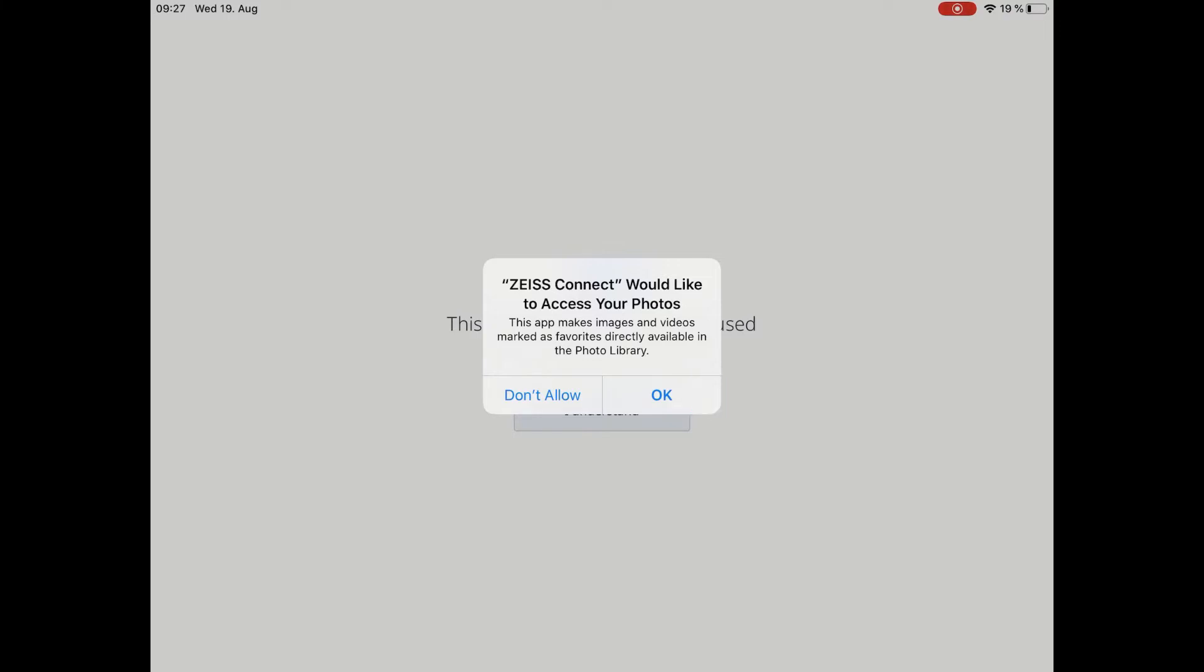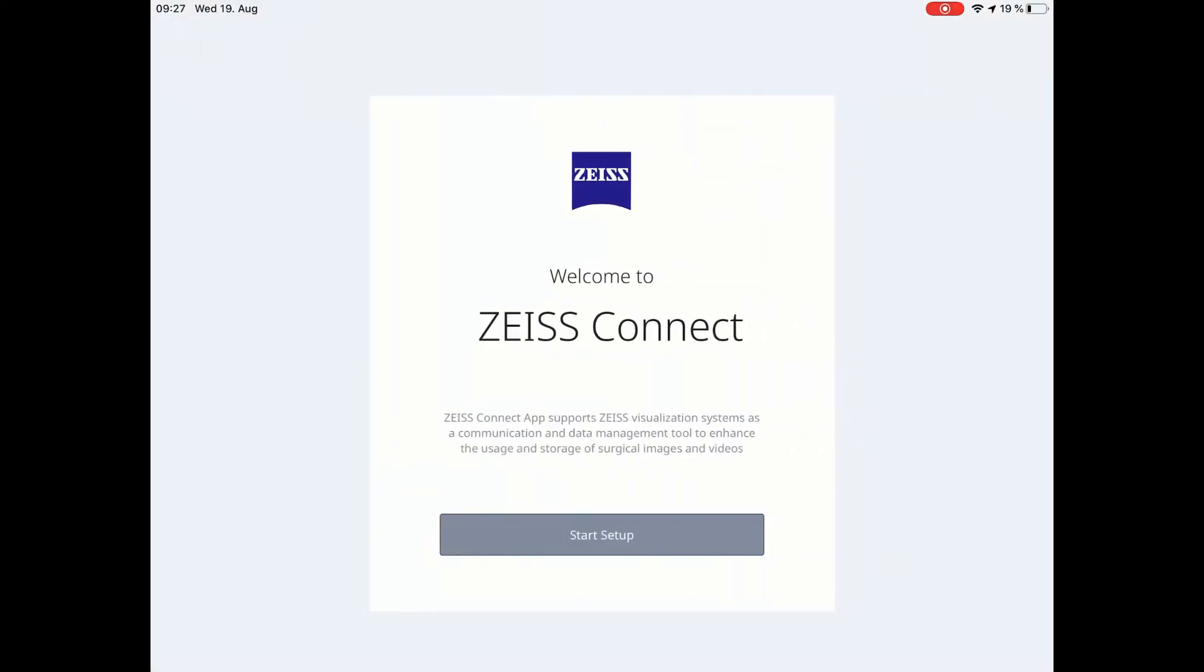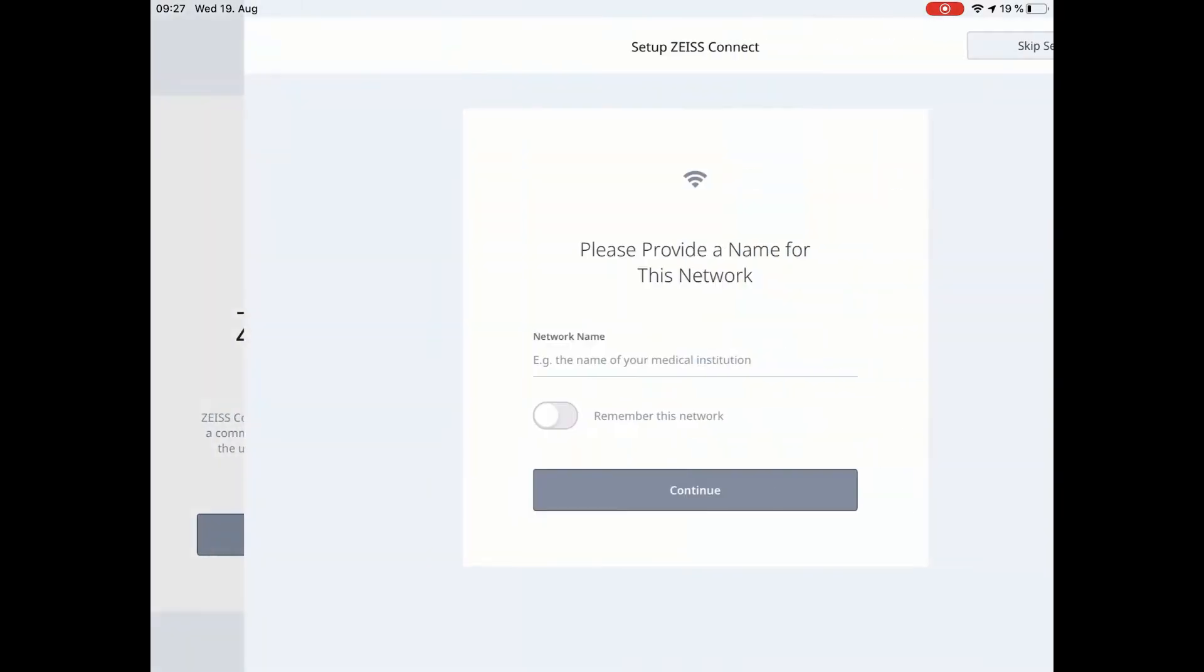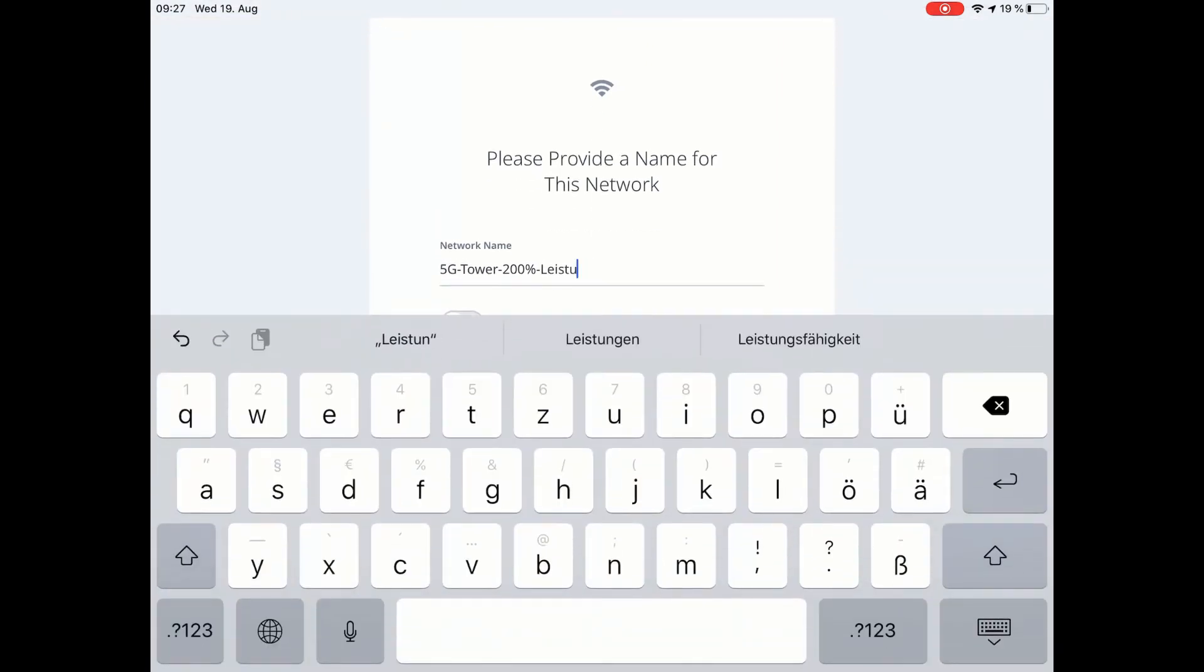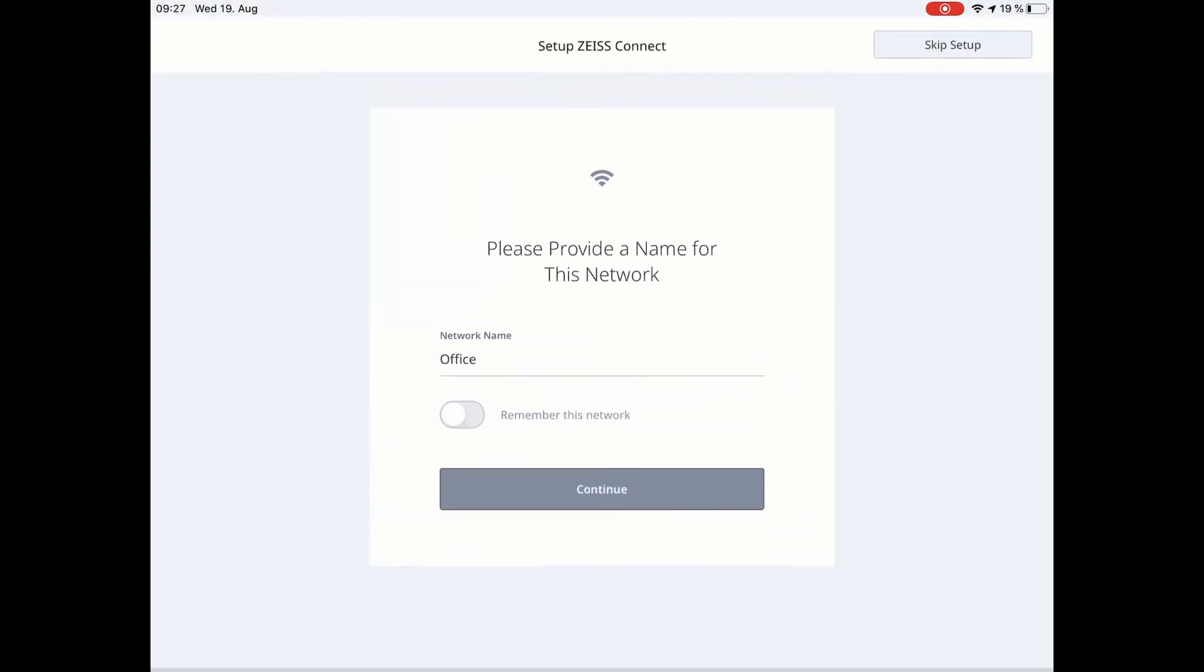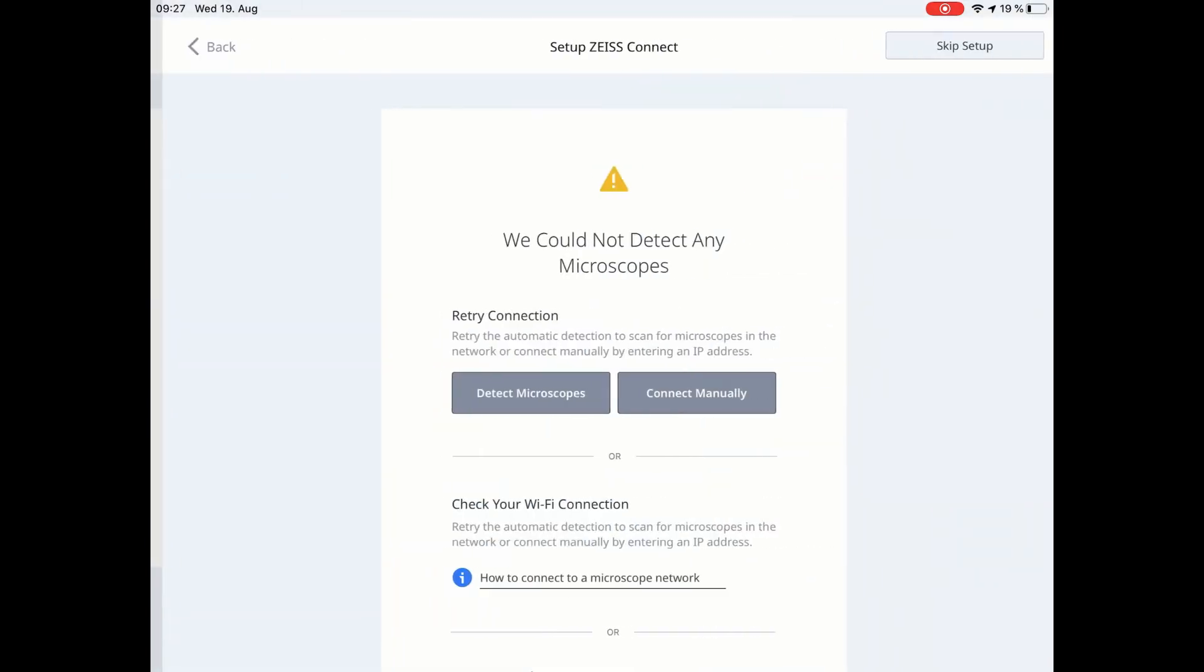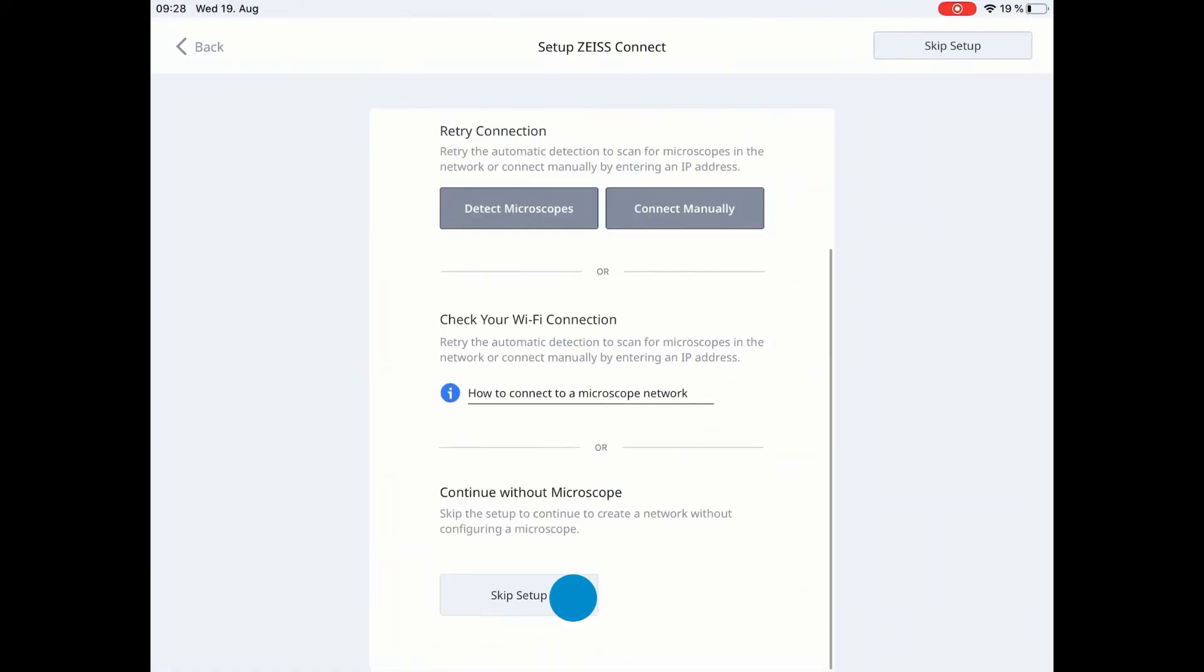Now you can start the setup. ZEISS Connect recognizes the network it is connected to by Wi-Fi directly. You can change the network name if desired. Because the practice network is configured here only, click on Skip Setup to continue without the microscope.